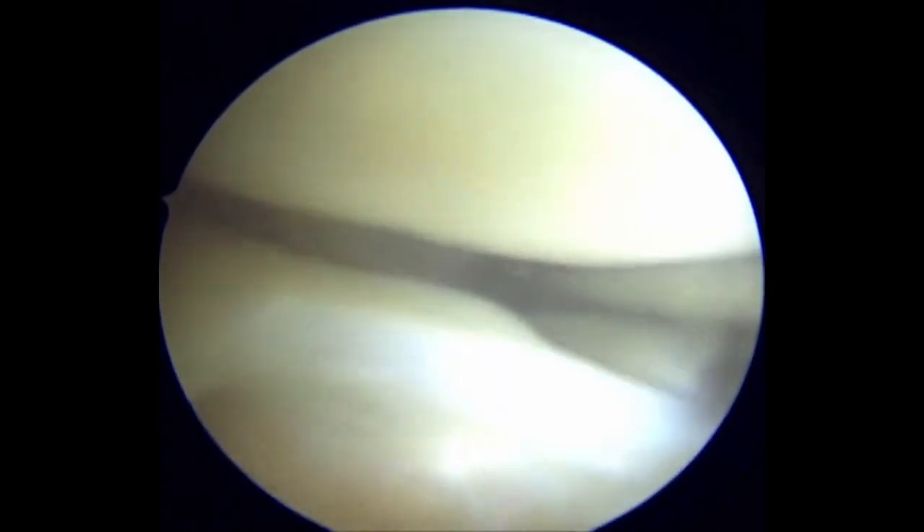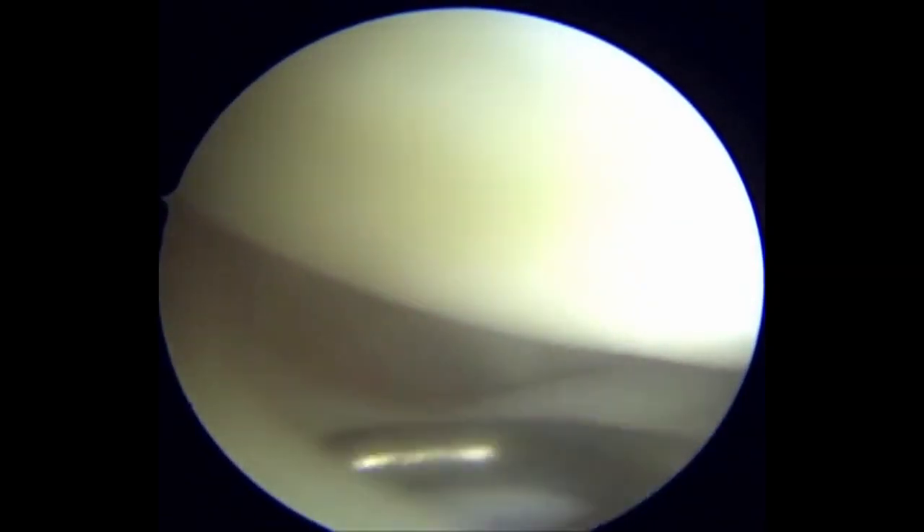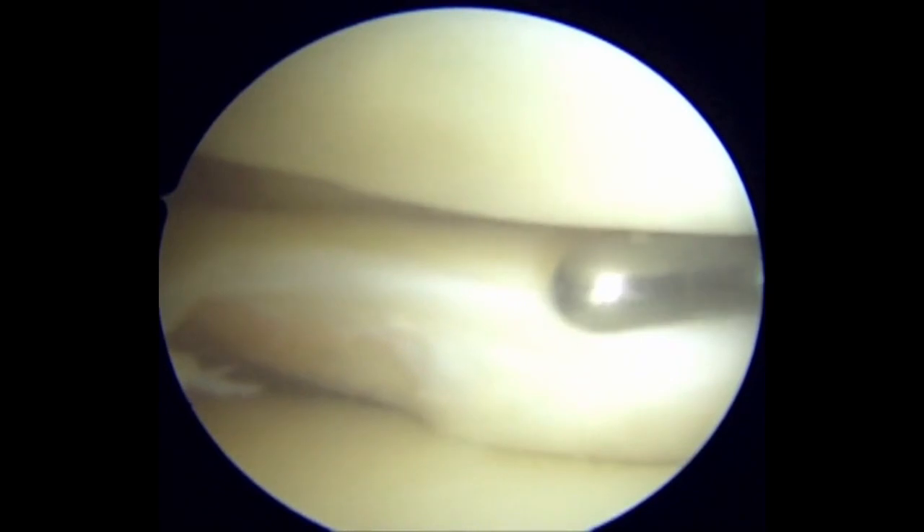The central posterior horn of the lateral meniscus is significantly thickened. There is also a defect at the junction of the lateral meniscus body and the posterior horn. This is one feature that can raise suspicion of a flap tear present.